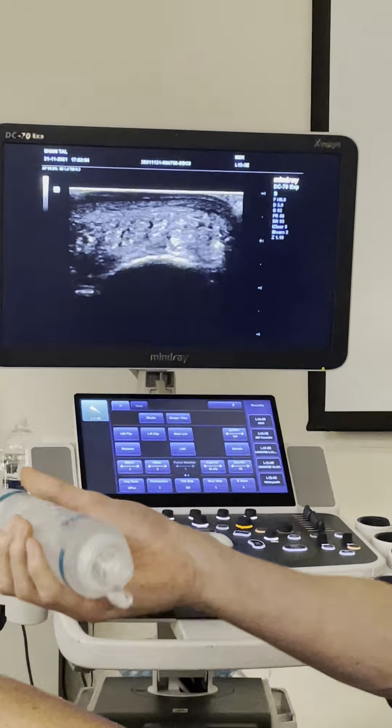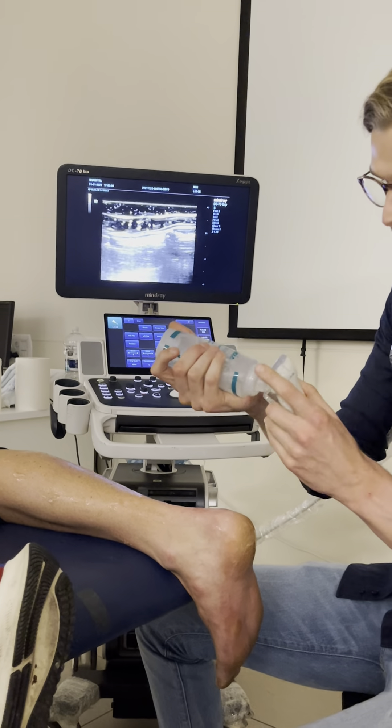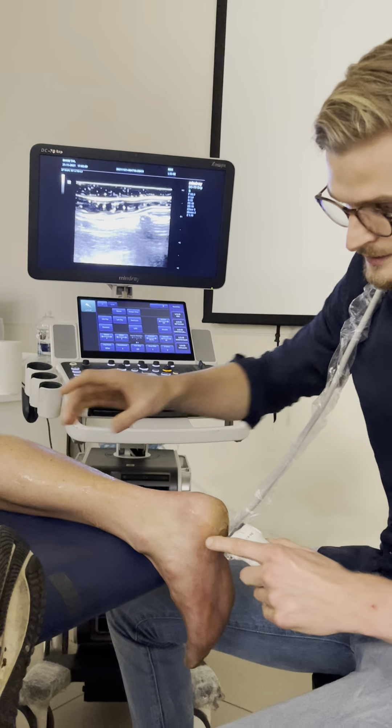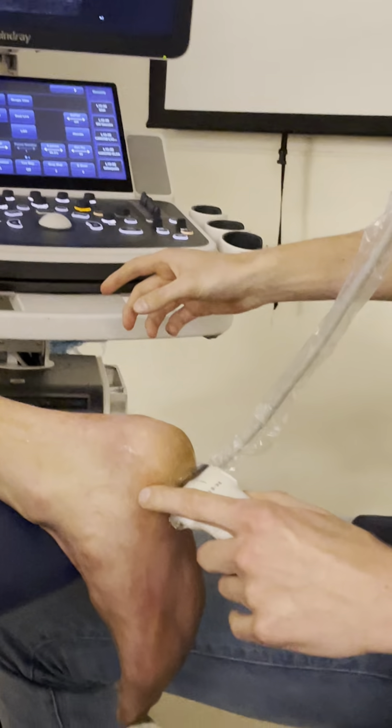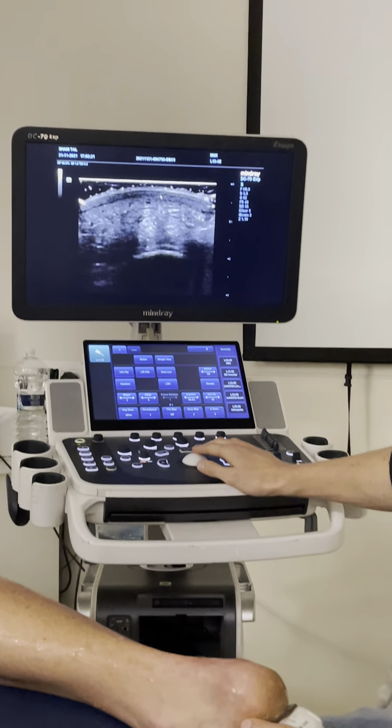Now I want to use a little bit more ultrasound gel — some extra layer — and I want to keep the extra layer in between my probe and the skin. If I do that, then I know for sure that I don't use any pressure.